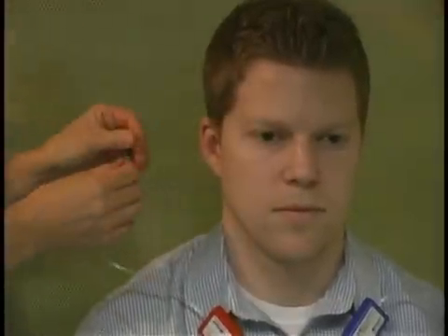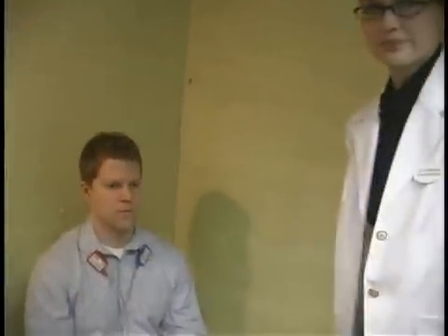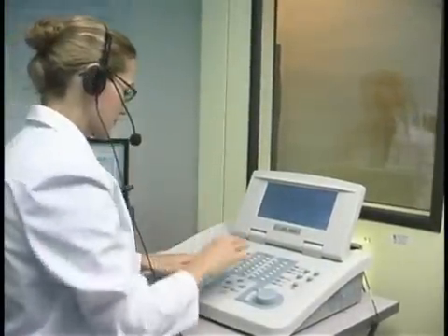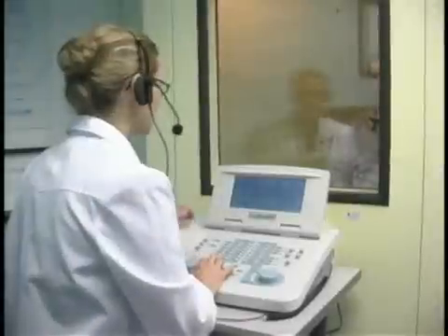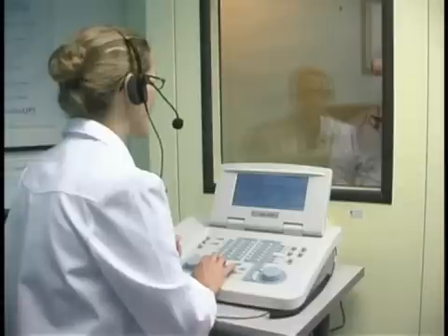Brandon, I'm just going to put these ear plugs in your ears, and then I'll go over and play some tones for you. I'm just going to play some tones in your right ear first — each time you hear one, just press the button, even if it's very very quiet.